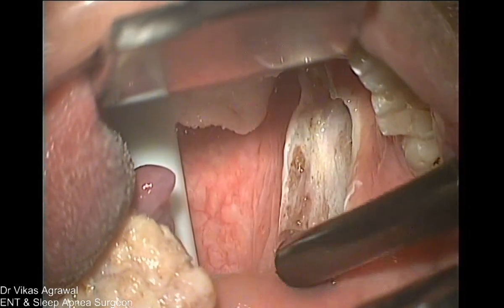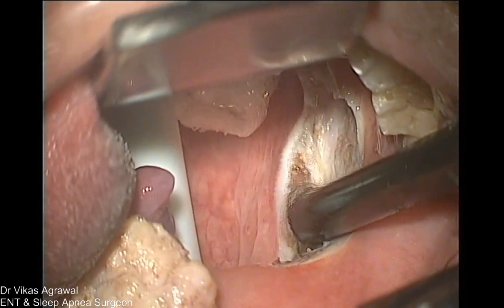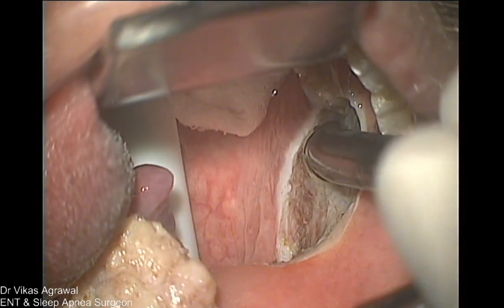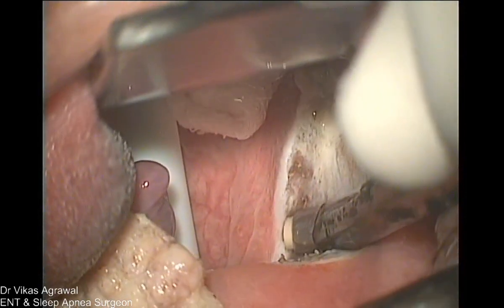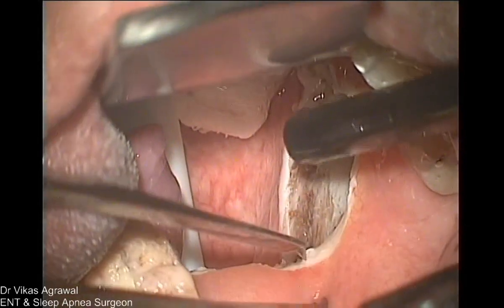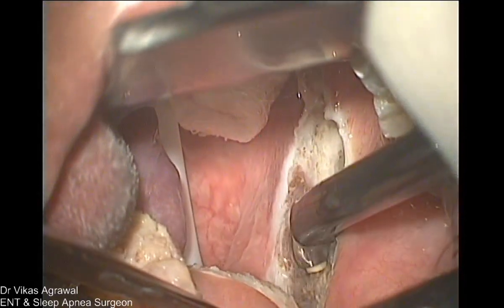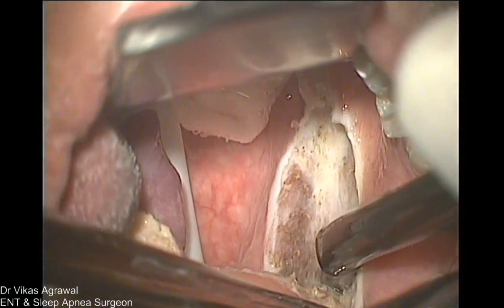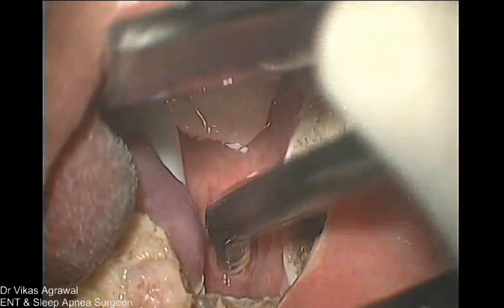And these fibers I am coagulating so that they fibrose, they do not cause any further obstruction. So just a coagulation from this raw area, preserving all the mucosa in the lateral and the posterior pharyngeal wall. See, this is the vertical fiber. So this will only fibrose vertically. This cannot fibrose laterally. This will not cause any stenosis. And this angle is 90 degrees, right?